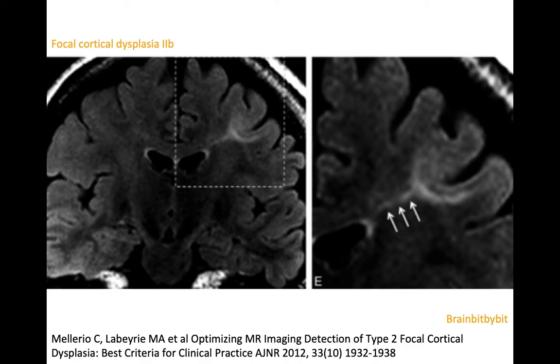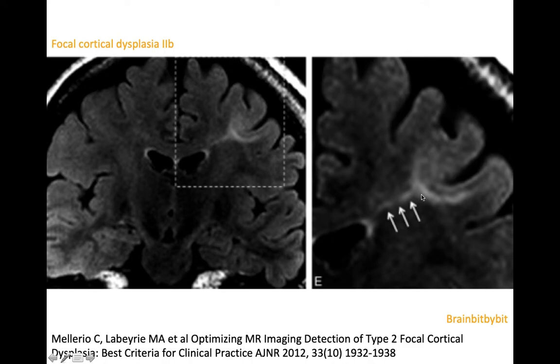On MRI, on T2 and FLAIR images as in this case, in FCD type 2, there is hyperintensity of the cortex and subcortical white matter, blurring of the grey-white matter interface, thickening of the cortex, and sometimes you see a transmantle sign, which is high signal extending from the ventricle all the way up to the cortical abnormality.